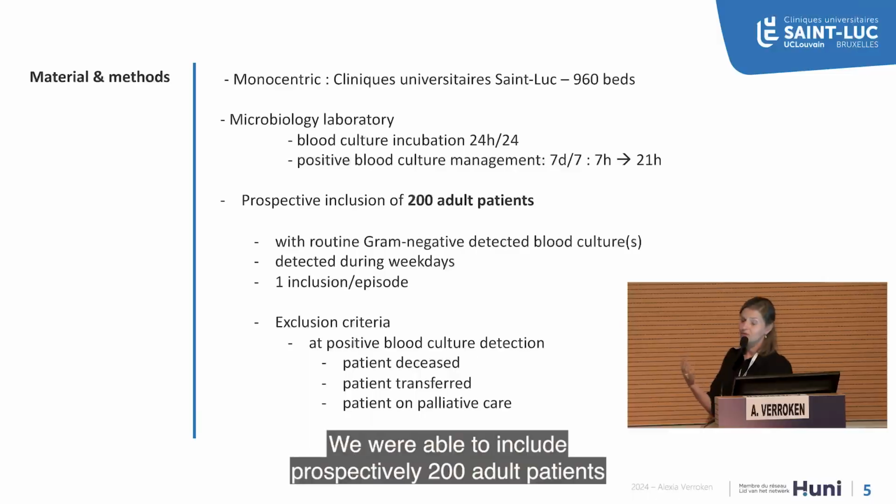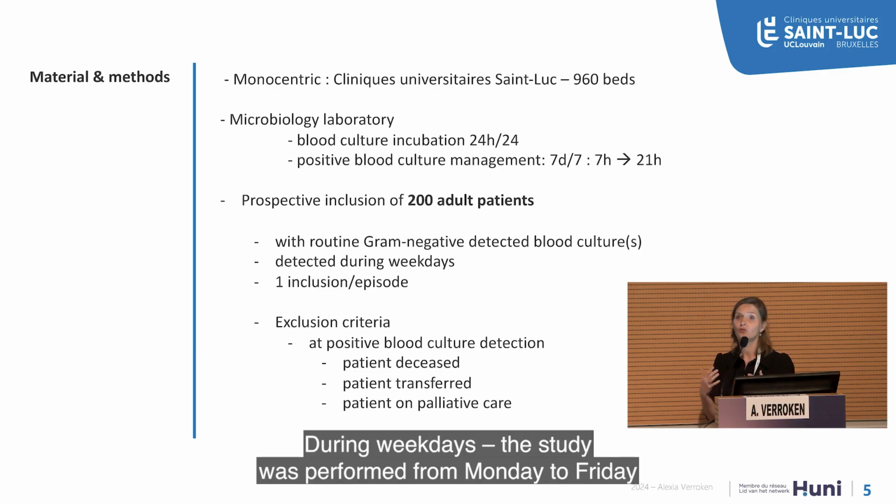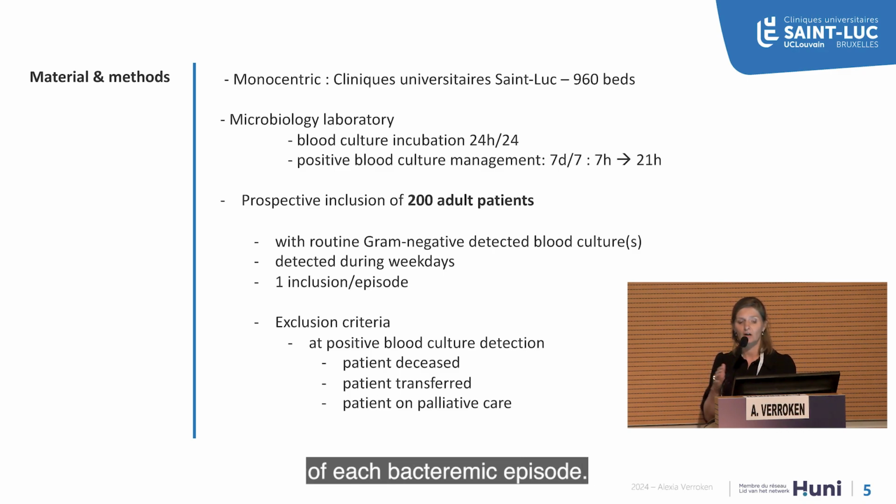So we were able to include prospectively 200 adult patients with a routine gram-negative detected blood culture during weekdays. The study was performed from Monday to Friday, and we always included the first positive blood culture of each bacteremic episode. What were the exclusion criteria?